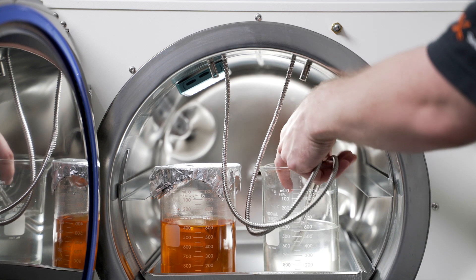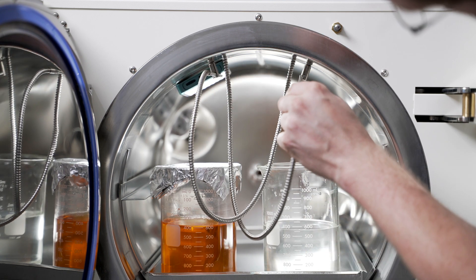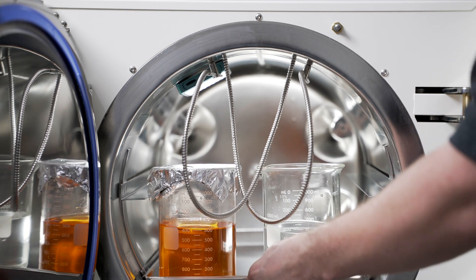At the end of the cycle, please be sure to remove the temperature probes and place them back into their holders at the top of the chamber. Watch out for the wiring to make sure it doesn't catch anything as you remove your media from the chamber.